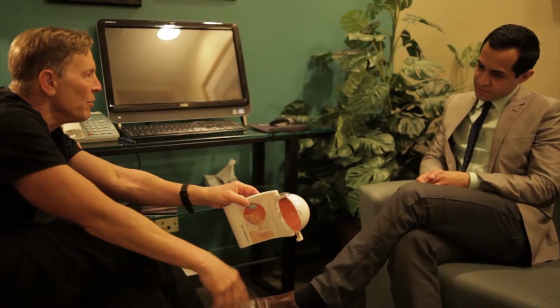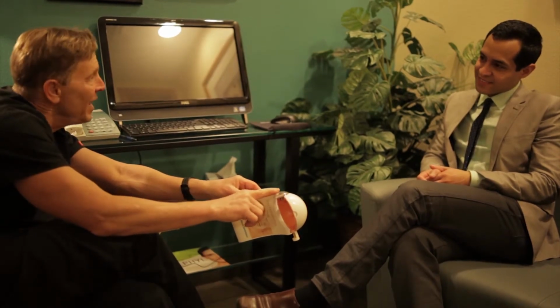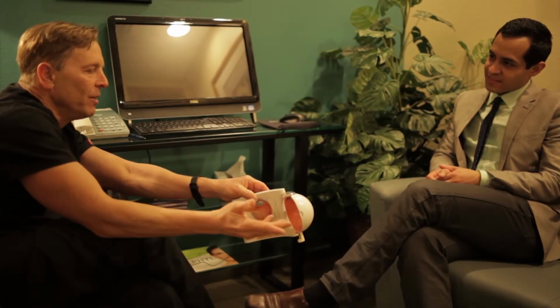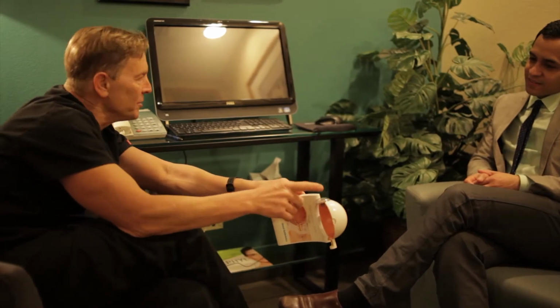So you were born with the wrong contact lens power, basically. So what we have to do is reshape that and flatten it. There's two ways to do it. You can do it with a laser and just flatten it, or you can put a contact lens on the eye and flatten it. To be permanent, we'll use a laser.